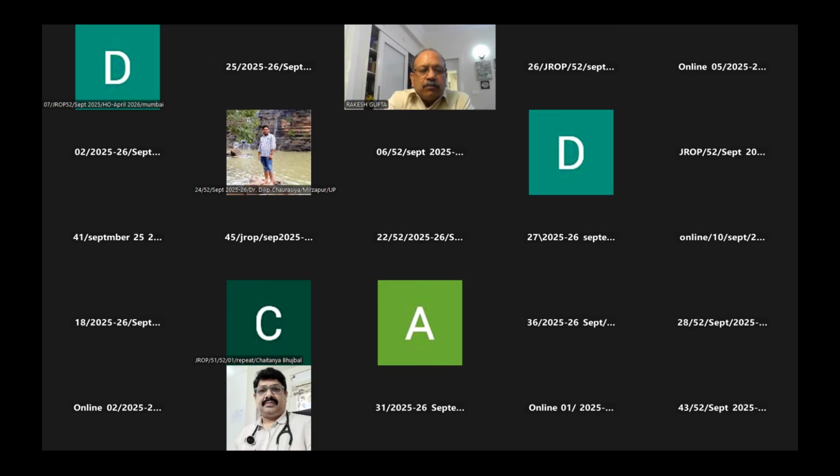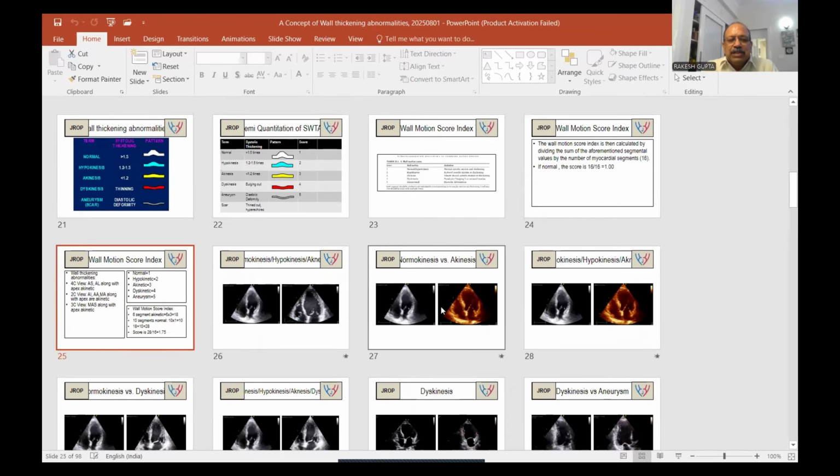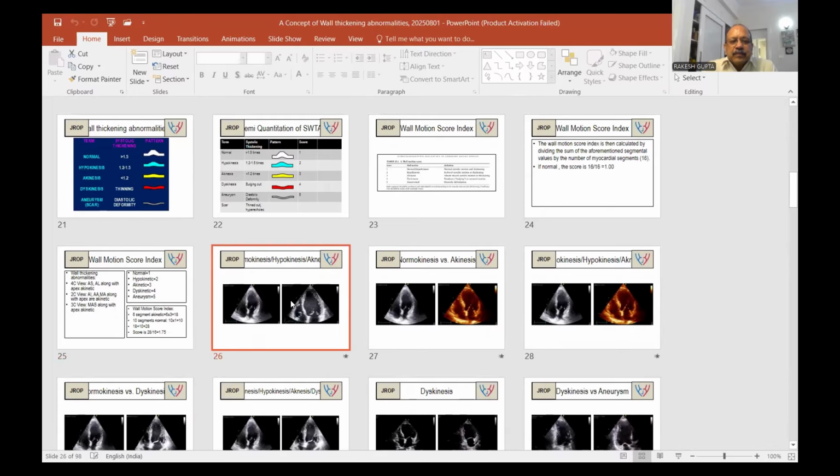And second question, sir, for akinesia and hypokinesia. Sir, can you explain with respect to endocardial thickening and movement again, sir? I still don't get it, sir. Okay, no issues, as many times as possible. I'll go back to my first slide because that has got everything in it. Can you see the slides? Yes, sir. All right.